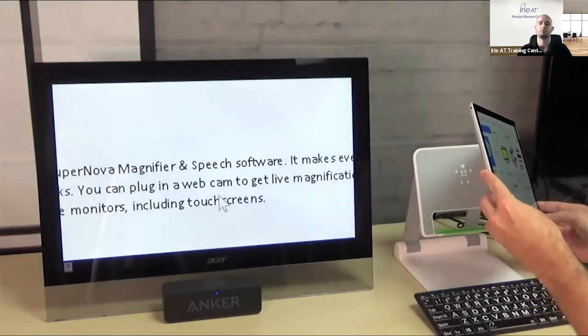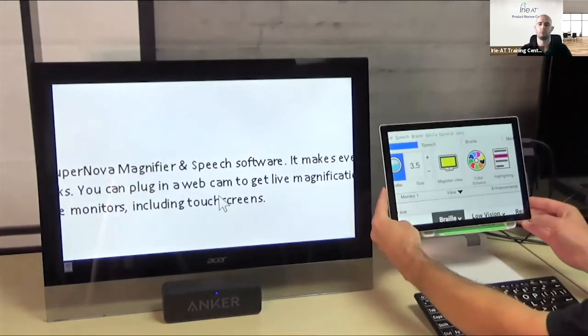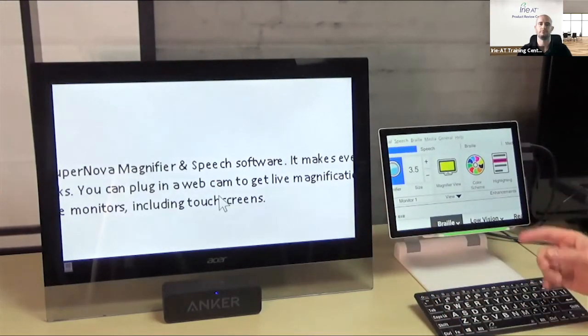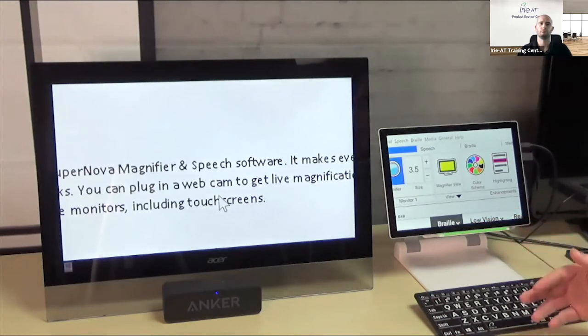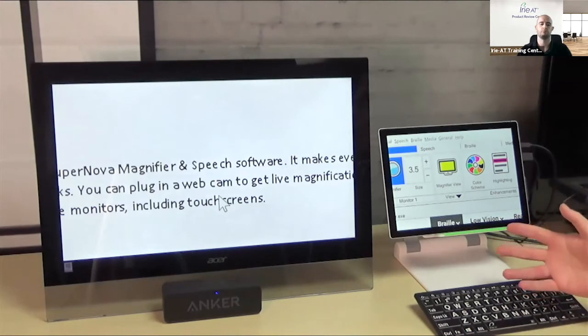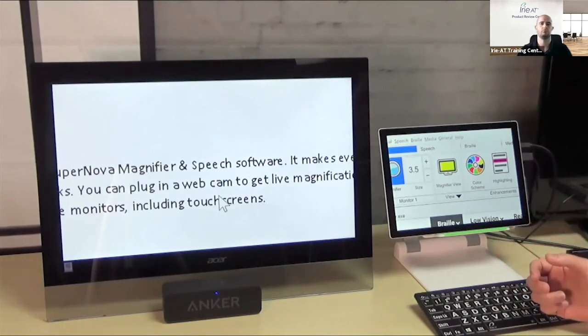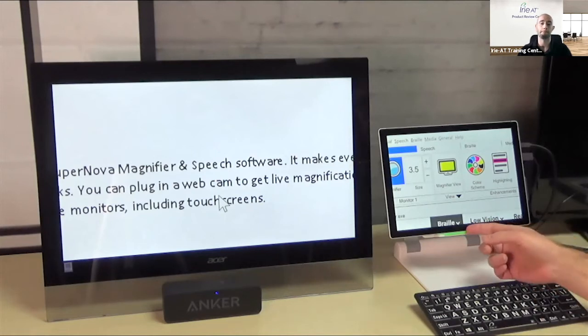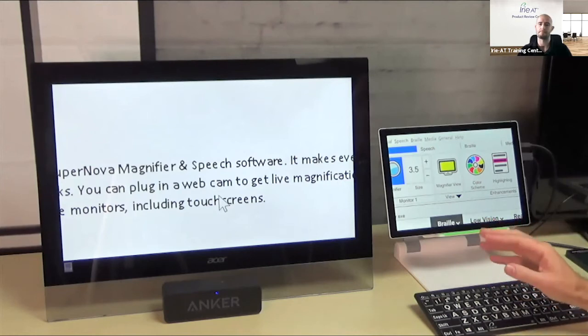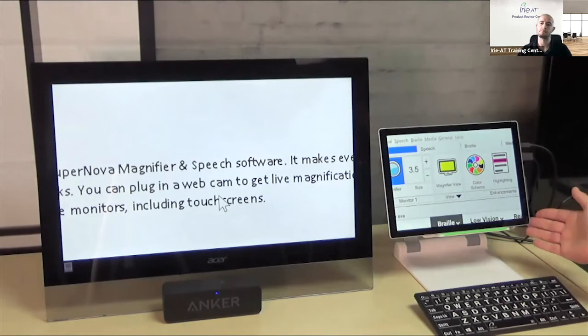Anyway, to start out, like Cody was saying, we're going to run this today on a Surface Pro. This is just a tablet, not a powerful computer. This particular one is an i5 with 8 gigs, which is above our minimum spec, but is what we recommend. If you want to run smoothly and be able to run other programs, look at an i5 processor with 8 gigs of RAM, and you'll be fine. Make sure you have an SSD, a solid state drive. I think I paid about $600 for this thing.